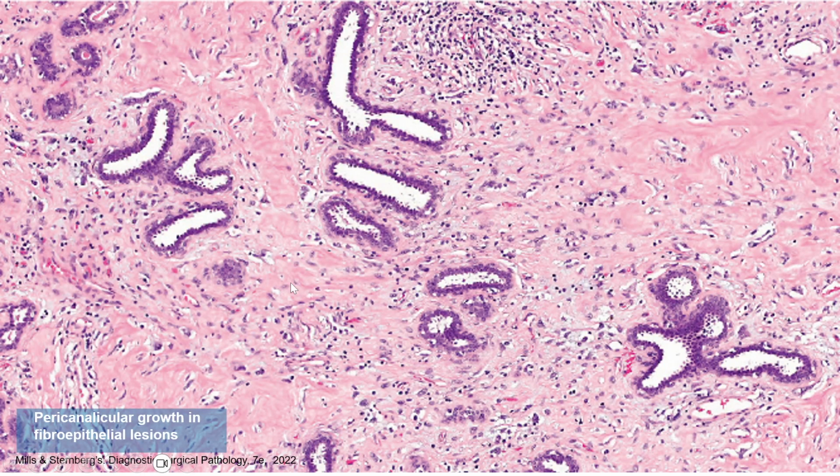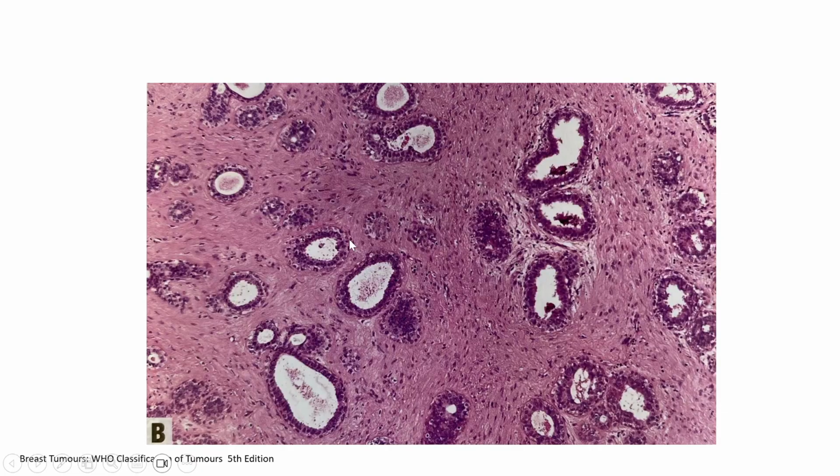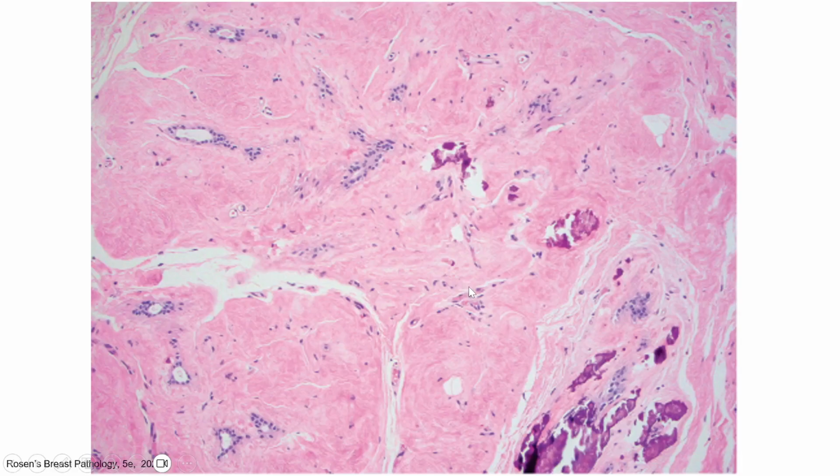That means the stroma overgrows between the glands, so it didn't compress the epithelial component. So you can see this open lumen, but we can see biphasic epithelial proliferation and also stromal proliferation. This is another one, also with open lumen. This is a pericanalicular growth pattern of the fibroadenoma.